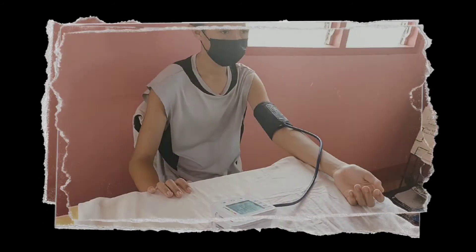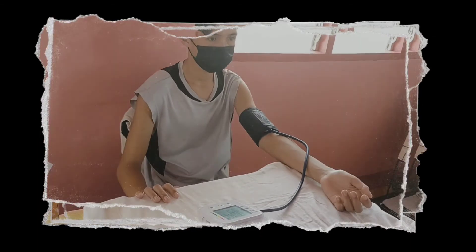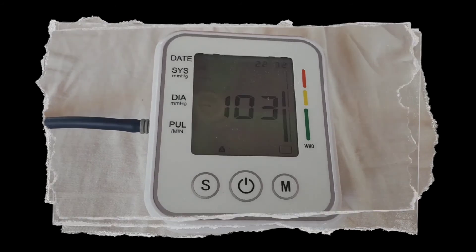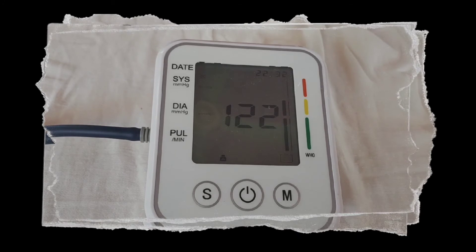Press the on/off button. Keep relaxed and start measuring. After about 40 seconds, the pressure and pulse are instantly displayed. The screen will show a digital readout of your systolic and diastolic blood pressure.